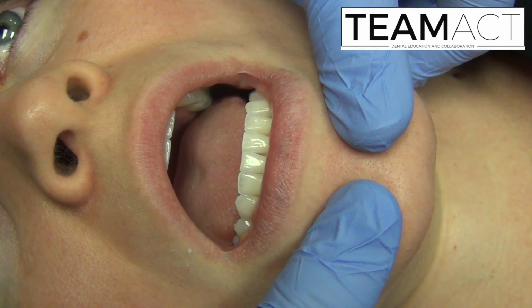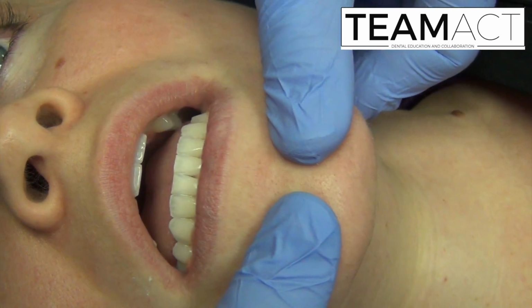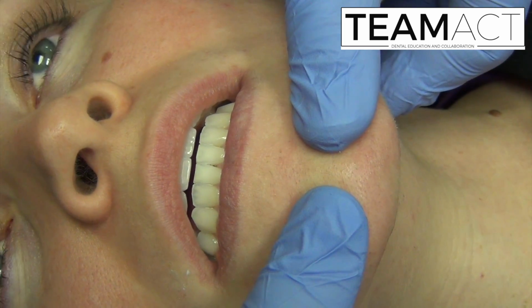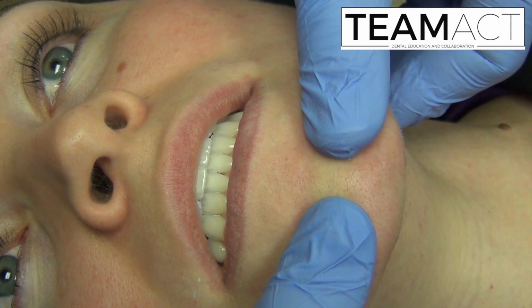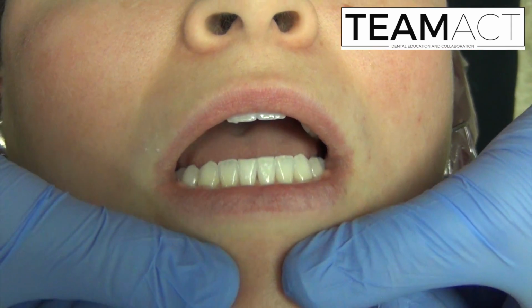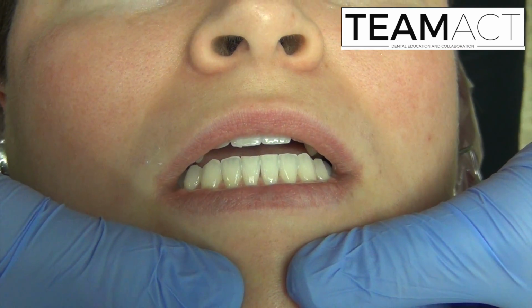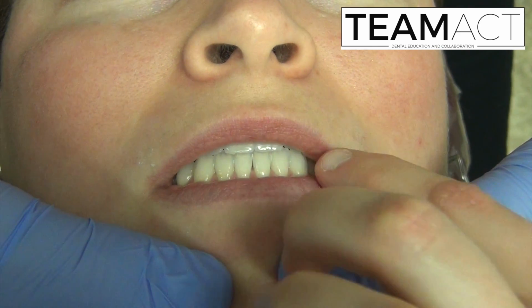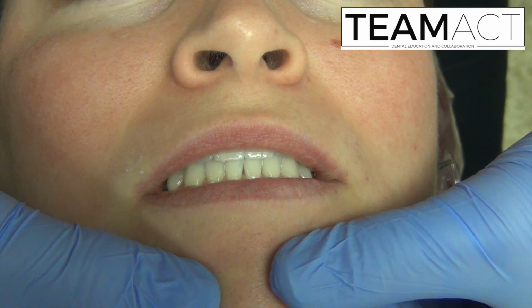Now we'll demonstrate the CR-CO slide, which is the first tooth contact and then closing into maximum intercuspation. You'll see here, first tooth contact is identified, then she fully closes into MIP, and you will see the slide. One more time. Again, she closes until that first tooth contacts, and then I'll instruct her to close fully, and you'll see the discrepancy from CR to CO.